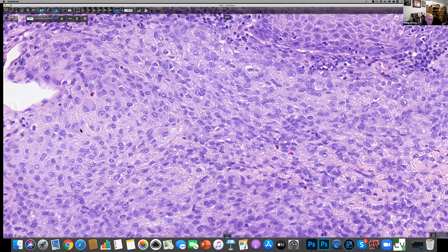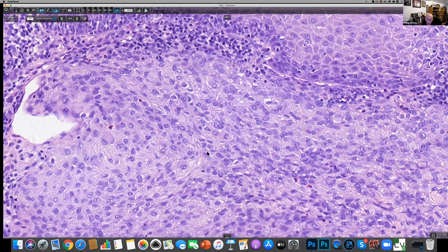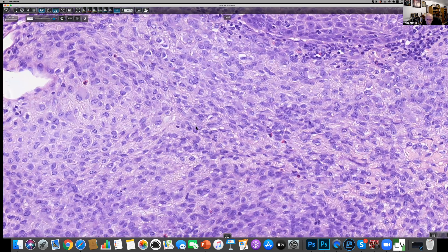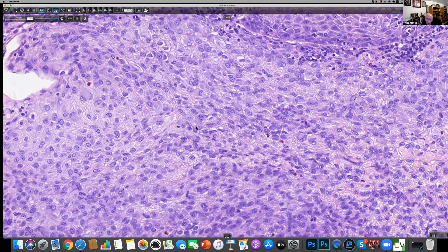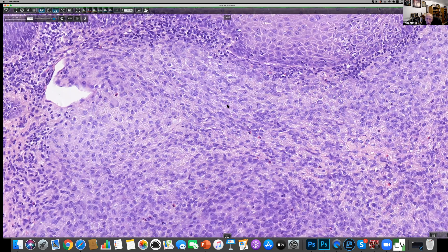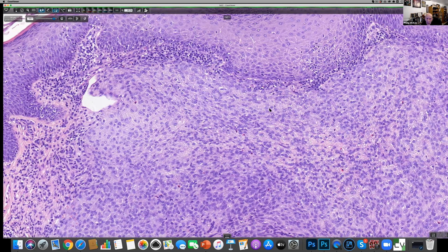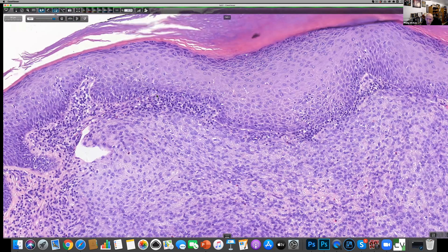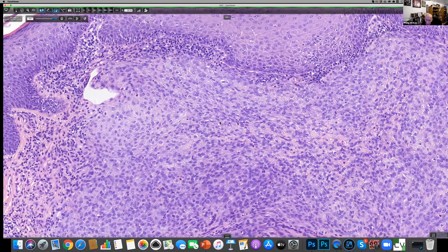If that were the case, you might wonder whether this might be a BAP1-inactivated nevus. However, we don't really have any junction activity, so that would be a little bit against that diagnosis.